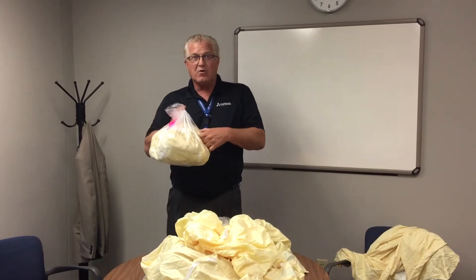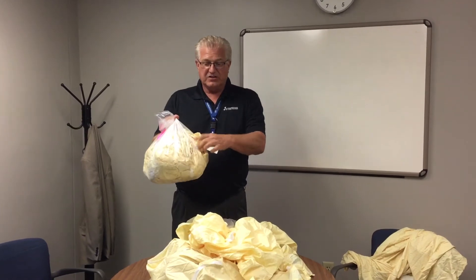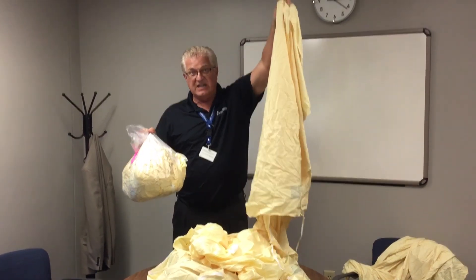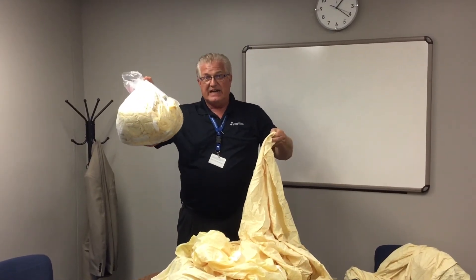This is the proper way to open up a bag of linen. Put a small hole on the side of the bag and pull out one isolation gown at a time, leaving the bag intact for the next user.